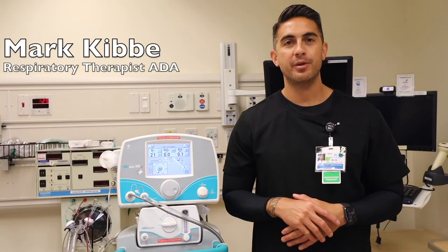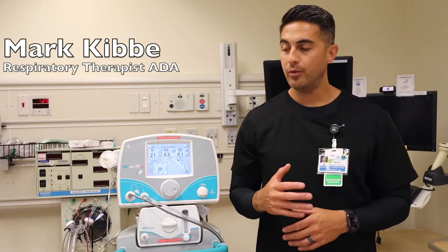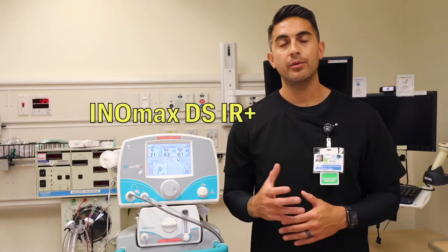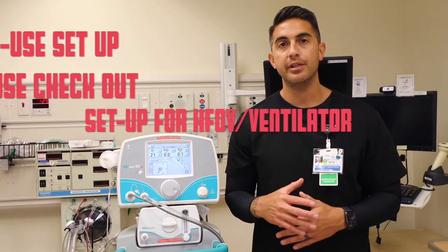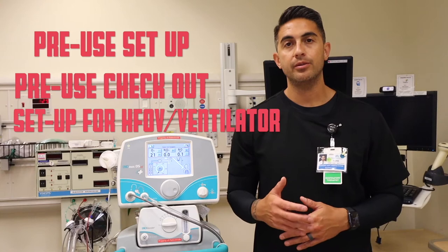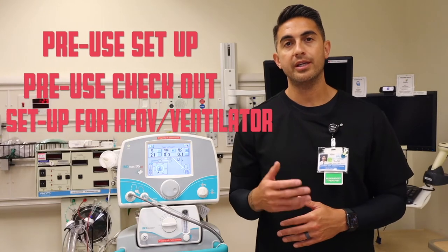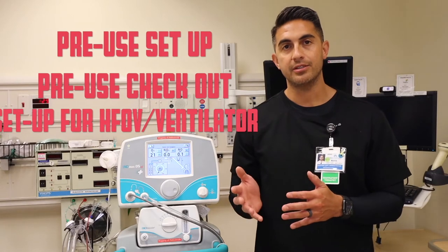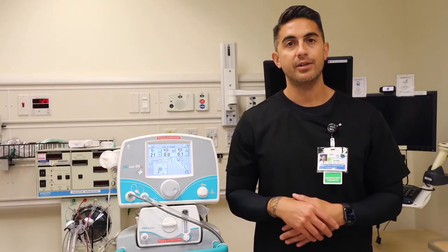Hi, my name is Mark Kibbe. I'm a respiratory therapist here at Kaiser Anaheim. Today we'll be reviewing the INOMAX DSIR Plus. We are going to review how to assemble the pre-use setup, how to do a pre-use checkout, and how to place the injector module and sampling line in both an adult circuit and high frequency circuit. So let's go ahead and take this together.